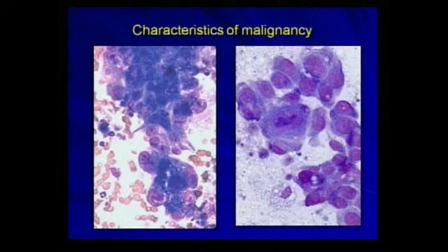Now, I'm very hesitant to diagnose malignancy based on a single cell, and I won't do it. But if you are looking around the cytology and you notice other cells or other clusters which contain similar appearing cells, then the potential for malignancy in this aspirate goes up dramatically.